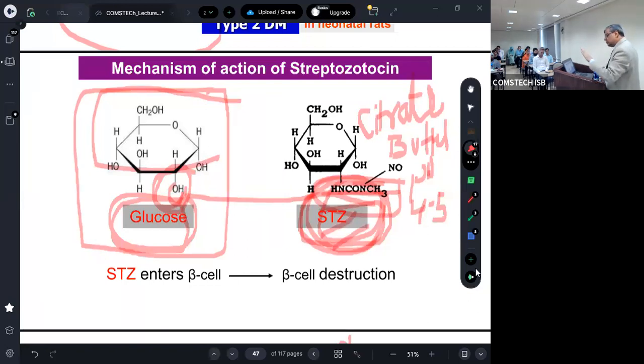We have the case numbers and the rat body weights. According to this, we weigh streptozotocin in individual tubes, or one tube for 2 rats. In this way we manage, and mashallah, in our cases the success rate is 80%, and mortality is less than 20%.